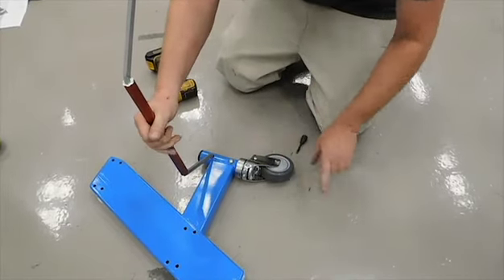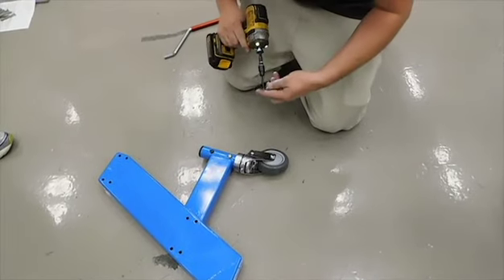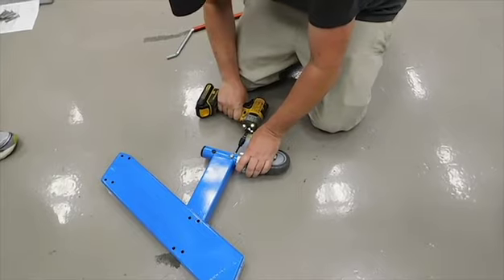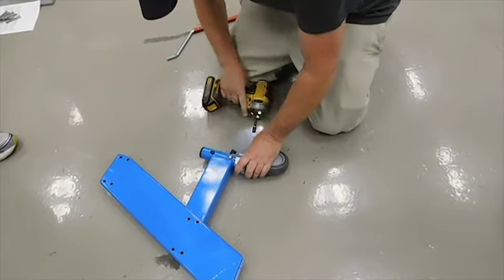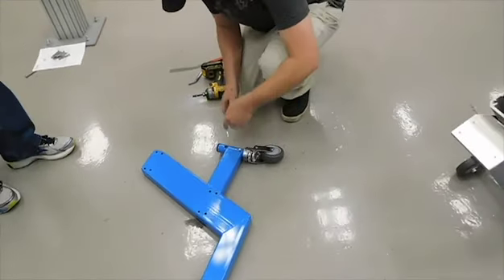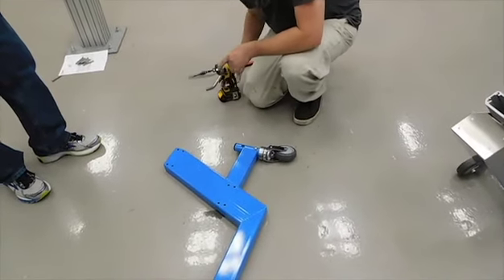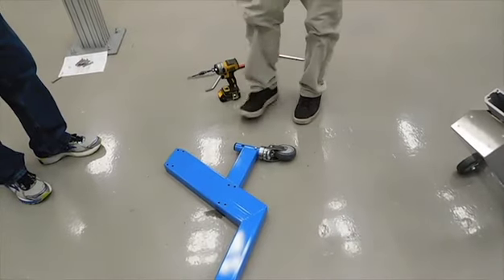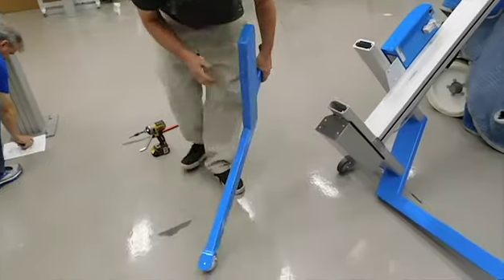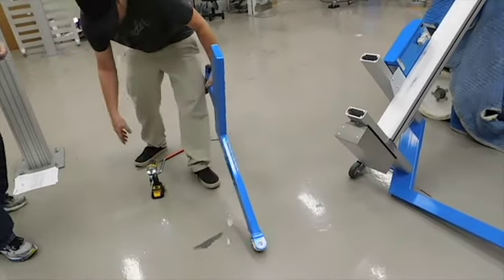You want to make sure that it's like that on both sides. What I would do is not put the brake rod back in until I have changed the other caster.